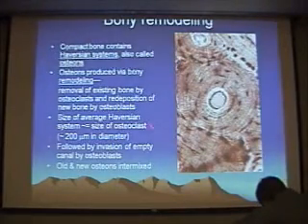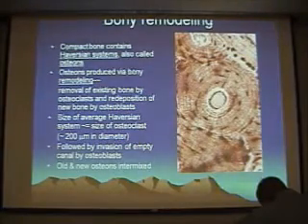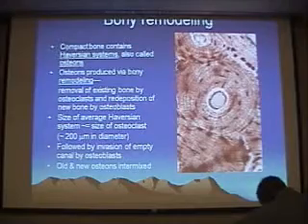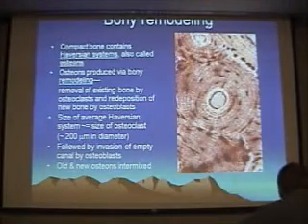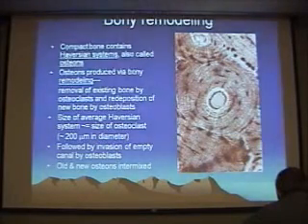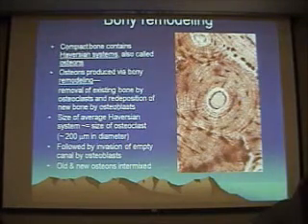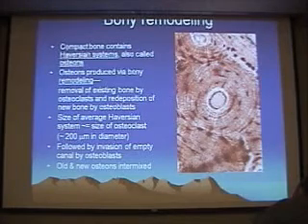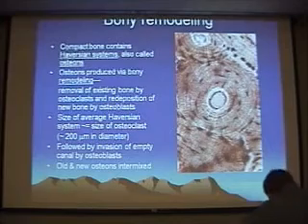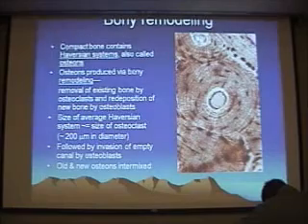And so when you look at a Haversian system in cross-section, you see a central canal, or Haversian canal, which would contain blood vessels and nerves in real life. Most of these are thin sections, and so as a result of that processing, the soft tissue is lost. And so you often can't see the blood vessels or nerves in the middle, and that's why they look empty. This represents bone. You can see these dark spots represent osteocytes, the mature bone cells, which are present within their little spaces, their lacunae.